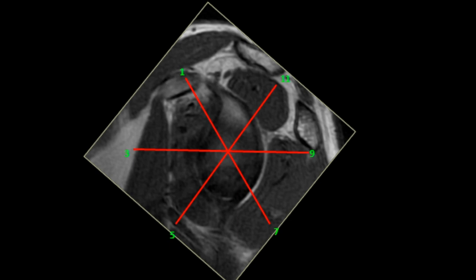We prefer to use the quadrant method where we talk of the superior, posterior superior, posterior inferior, inferior, anterior inferior and anterior superior quadrants of the labrum. For example, I will describe a tear as: tear involving the entire anterior labrum extending across 12 o'clock up to the posterior equator. This gives the surgeon the entire extent of the labral tear so that he can plan the surgery accordingly.